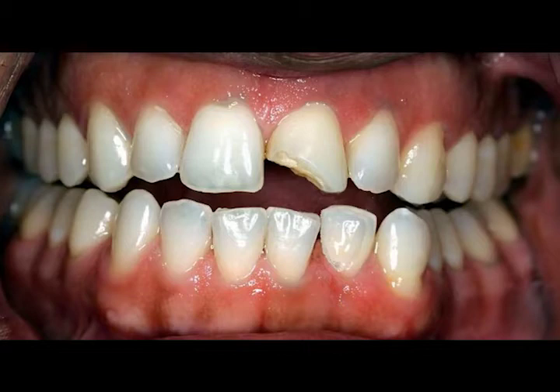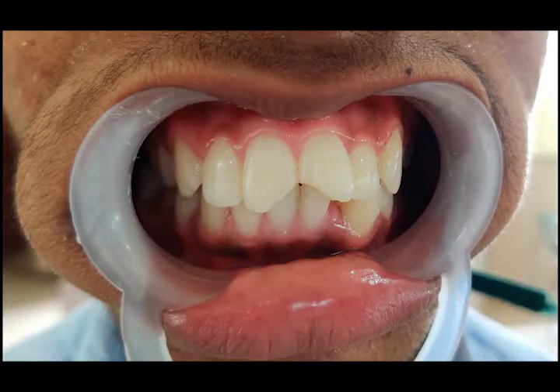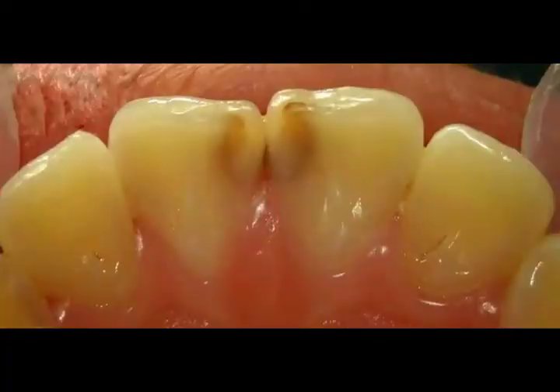In this video, we are going to be looking at the tooth for GV Black's Class 4 situation. This is usually seen when there is a fracture of the incisal edge, and in cases where the carious lesion is located at the proximal faces on the anterior teeth affecting the incisal angle.